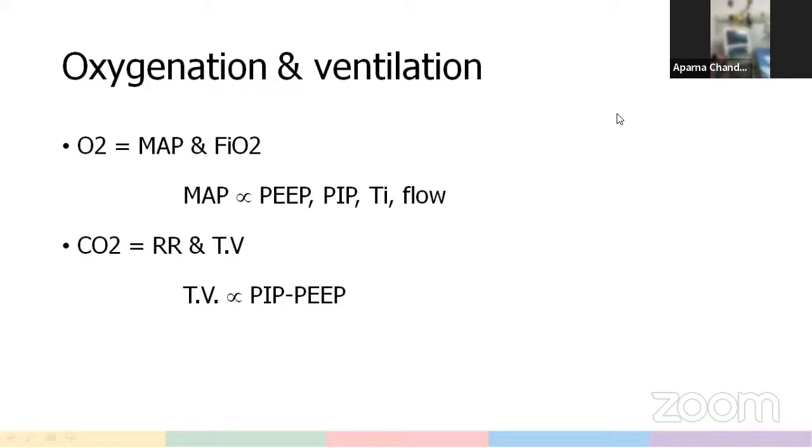So until the settings are being adjusted, every ventilator, we know, comes with the following parts. We have the gas source, which is a combination of oxygen as well as air. This gas source is blended within the ventilator, and we have a series of pressure regulators here with an inbuilt compressor, which will compress or pressurize the gas to a total pressure of 100 psi. The inbuilt blender also helps us to deliver the FiO2 that we desire.